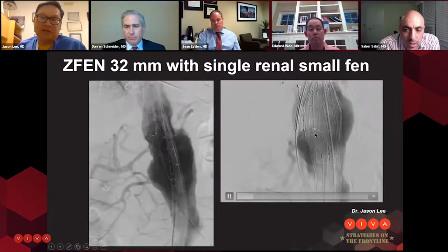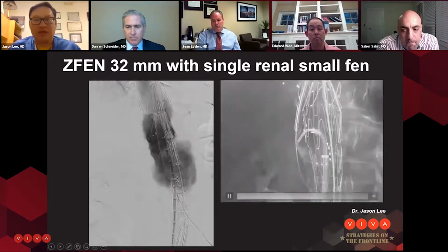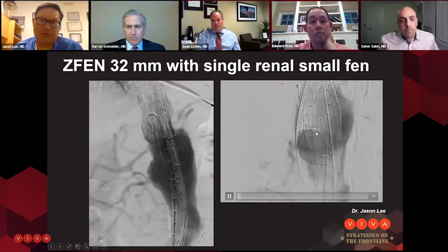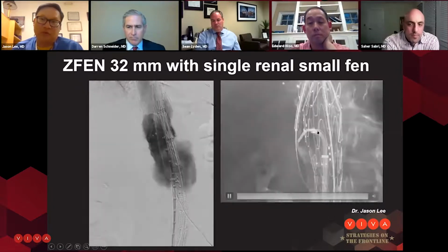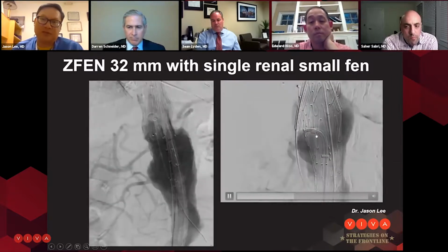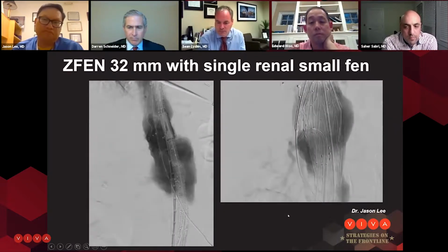Can you comment on whether you have a tip deflecting sheath in there? Yeah, that's a Tour Guide there. That's a 6.5 Oscor. I've switched to using these exclusively to not have to deal with all the additional radiation. I think these work really well. This is a 6.5 Oscor with a 100 vert, and we basically use this to catheterize, to get out the fenestration, to be pointed at the target vessel.